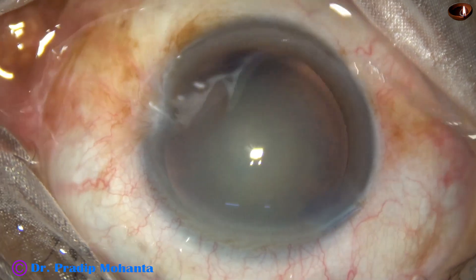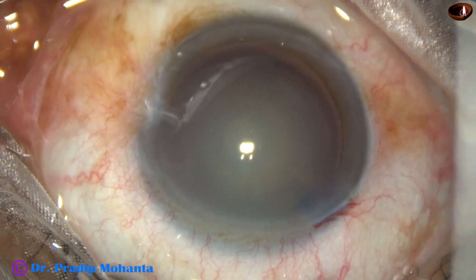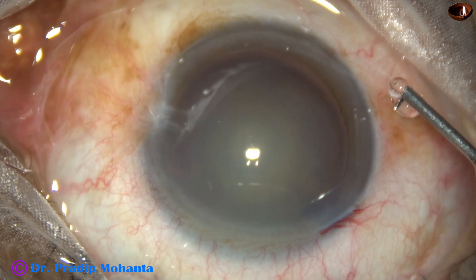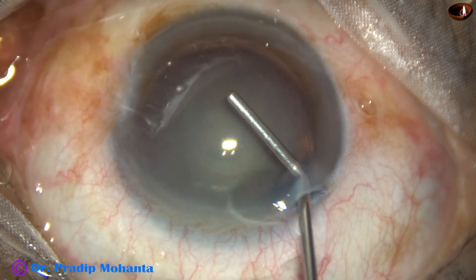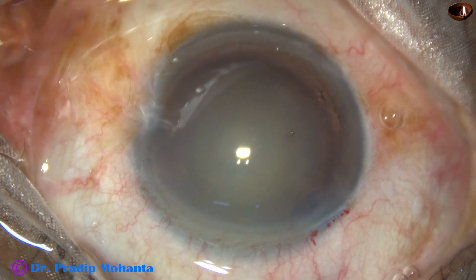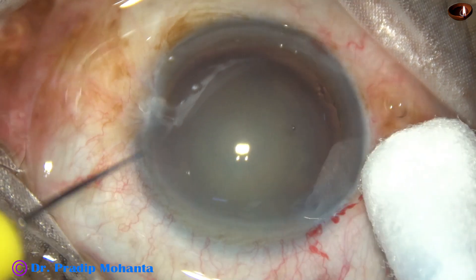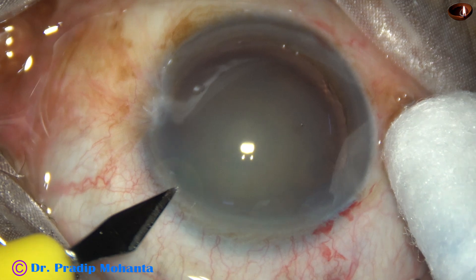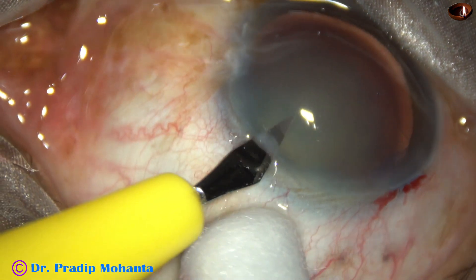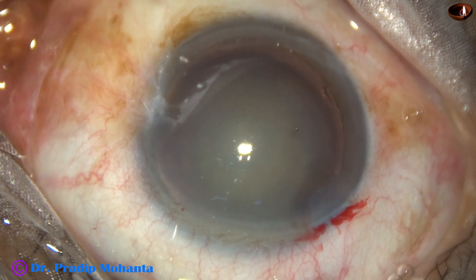And now the anterior chamber is again filled up with viscoelastic substance. In this case, it is 2% hydroxypropyl methyl cellulose. One more side port is made on the left side of the main incision. So in this case, we have 2 side ports and one main incision.